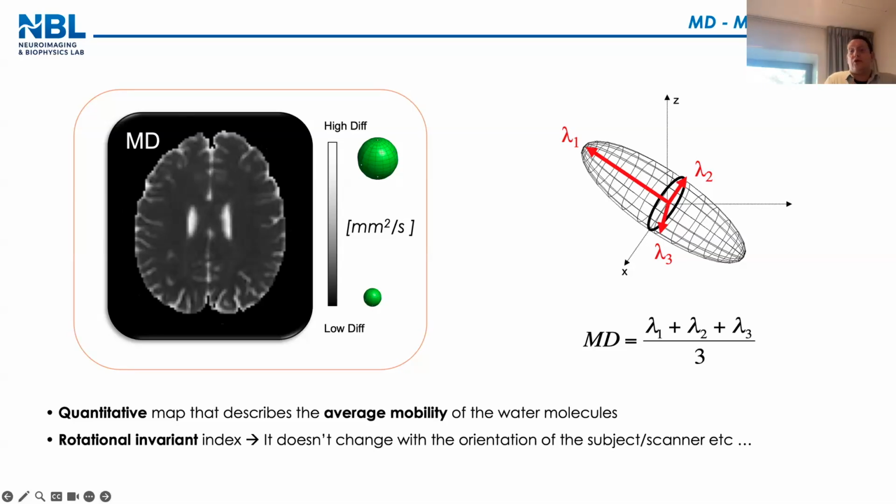But what they do is a DWI and they do an ADC. Why do they call it like that? Because the scanner automatically does the mean for them, so they don't know. Exactly. It's just the average of 3 axes. So this is pure clinical scan. You're never going to see this in research. So on the scanner, when you do a clinical ADC or clinical DWI, you just get an average automatically of three axes of diffusion, so that you remove any anisotropy and you can see an approximation of mean ADC.